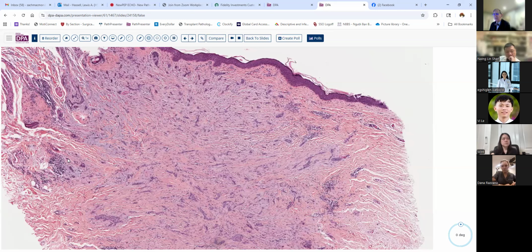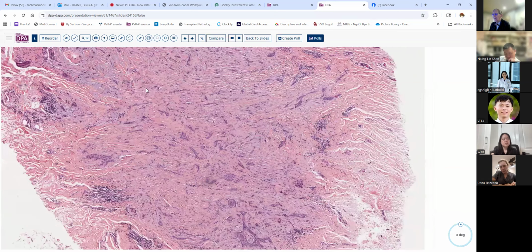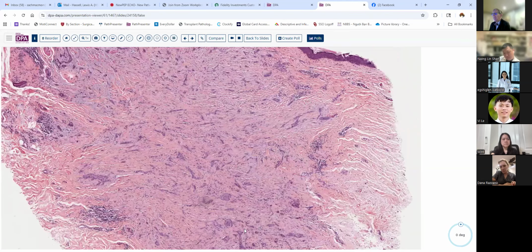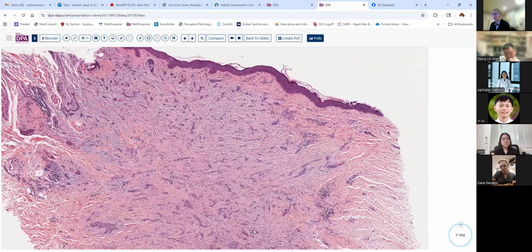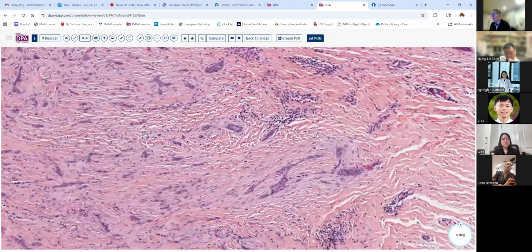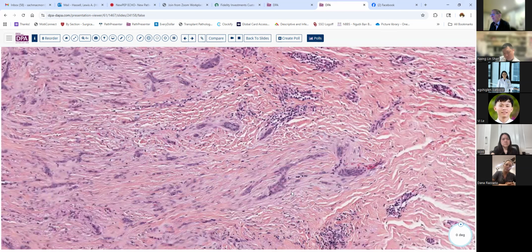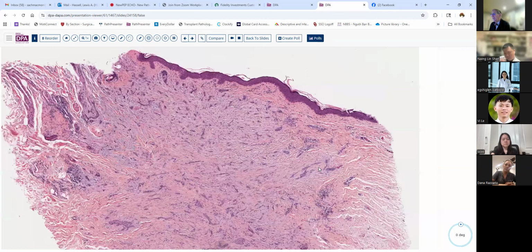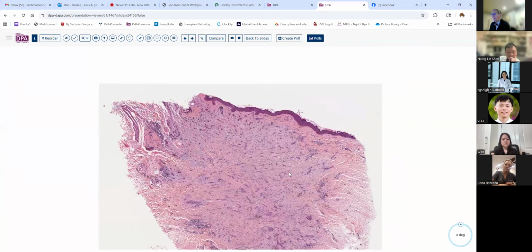See how it's sort of trickling off over here. Its deep extent, and so forth. And this is one of the lesions, if this presents on the face or something like that, or in a sensitive area, this is when they would be very, very inclined to use Mohs surgery to make sure that they didn't have any of this sort of reactive tissue or these potentially neoplastic nests in their final margins, because you don't want to leave this behind because it can come back with a vengeance.